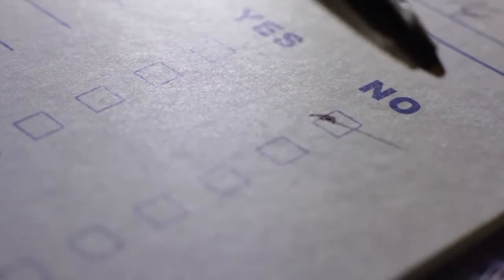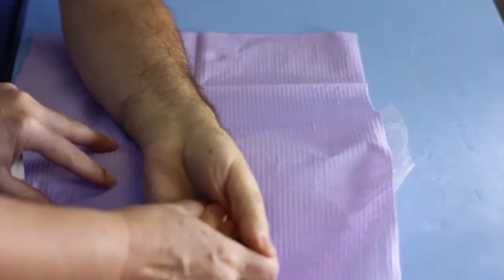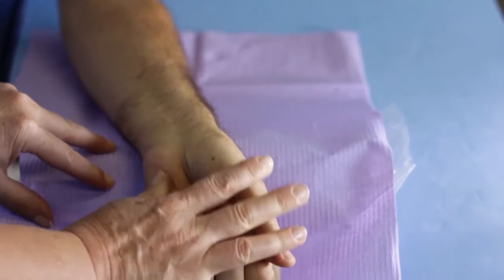Second, ask the patient questions regarding possible allergies, bleeding disorders, etc., and ensure that your patient is in a comfortable and suitable position for the procedure.